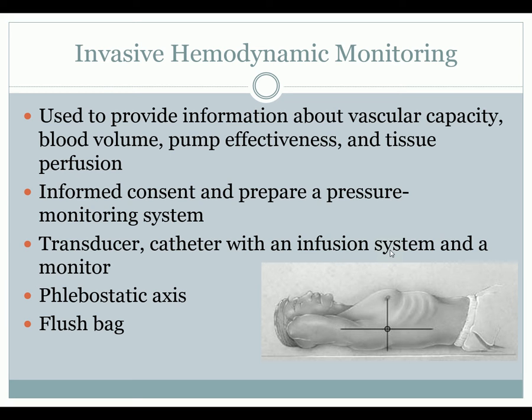Invasive hemodynamic monitoring is used to provide information about a lot of things. You always want to get informed consent and be able to prepare a pressured monitoring system and set it up. Again, I have posted a YouTube video for you that will show you how to do this. If you come in and a patient has invasive hemodynamic monitoring, these patients are usually seriously ill patients that need more accurate measurements of their blood pressure, their heart function, and their volume status. So they're sicker.